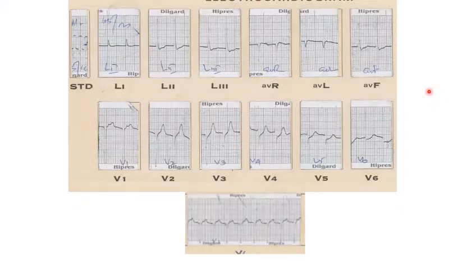But no, you are right that when the P is outside the QRS complex, usually in a patient with AVNRT, the P is either fully inside the QRS complex or most of it is inside. But in AVRT, it is very often outside the QRS complex, and that is taken as a point to differentiate between AVRT and AVNRT. Why is it so? Sriram, why is it so?